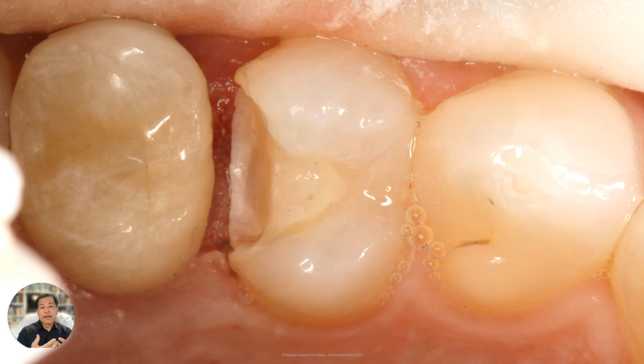So in my hands, QuickStat Free works very well. And I'm just trying to figure out how I can convey the technique of using QuickStat Free so you all can enjoy the same type of success. So bloody area, apply, don't scrub, apply the QuickStat Free to the areas that are bleeding, and then rinse it and dry it, and you should have great success. So that's what I'm experiencing clinically.